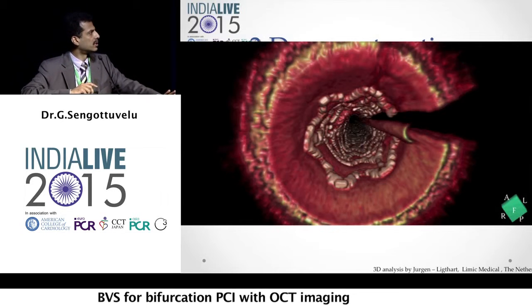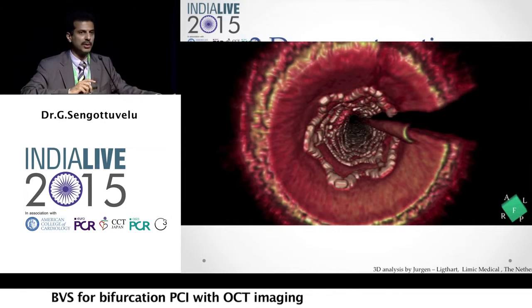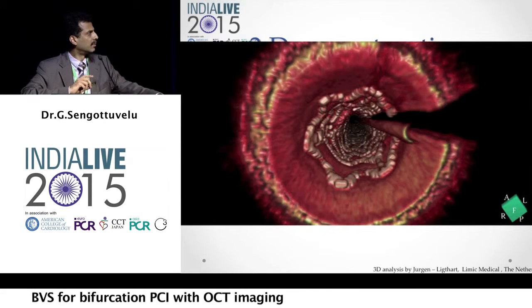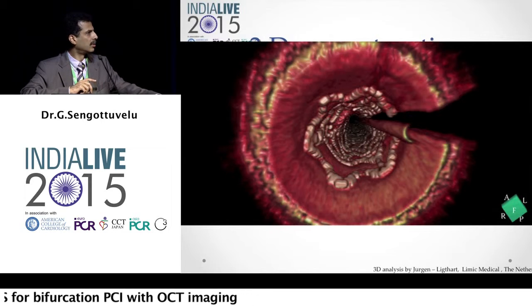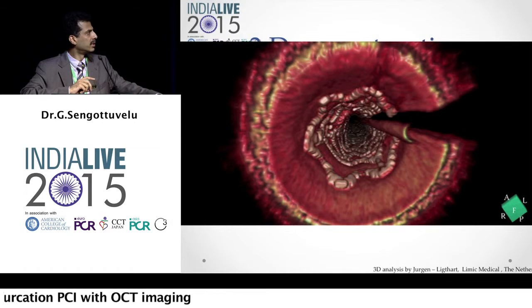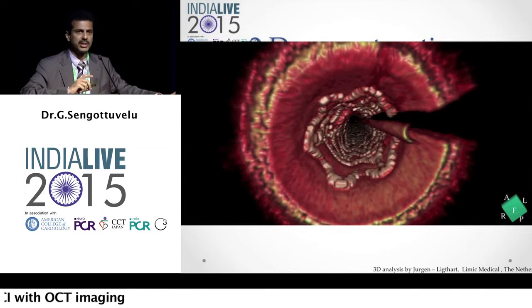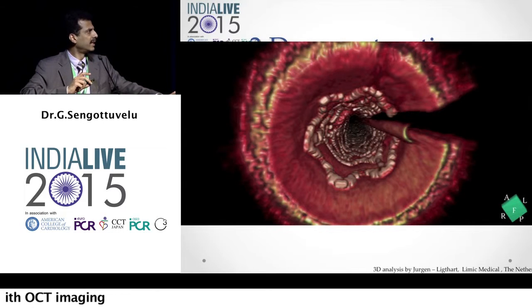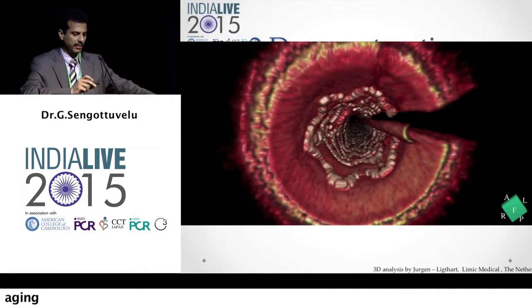There is no deformation, and we also looked at the diagonal ostium to assess the bifurcation. All through, the scaffold was looking very good. The 3D reconstruction really helps to know the integrity of the scaffold, particularly when doing complex cases — as we are learning to use scaffold in more real-world cases. You could see the ostium of the diagonal very well patent and well-opened.